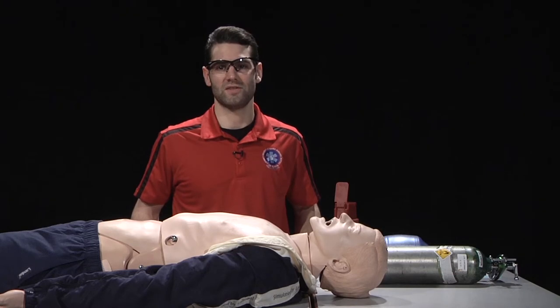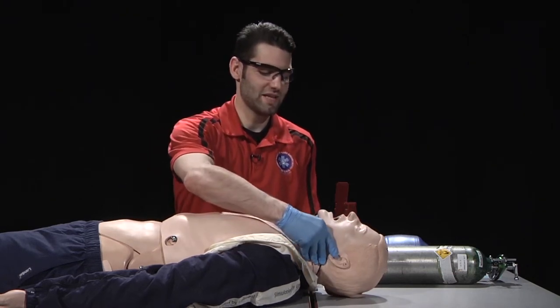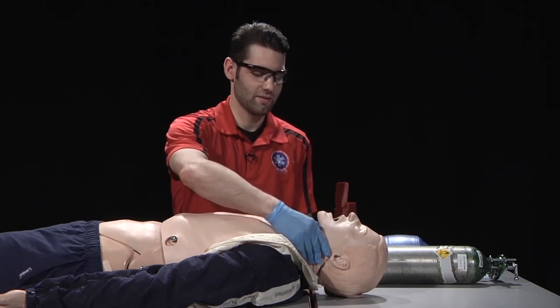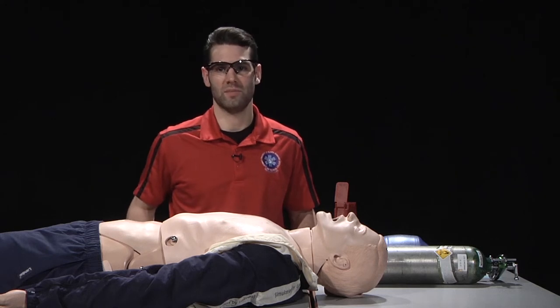Once I've gathered all the necessary equipment and the patient is laying supine, I'd hyperextend the neck unless trauma is suspected and manage the patient's airway with basic maneuvers and supplemental oxygen.